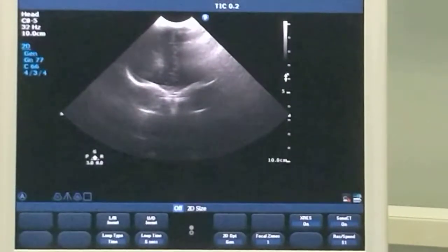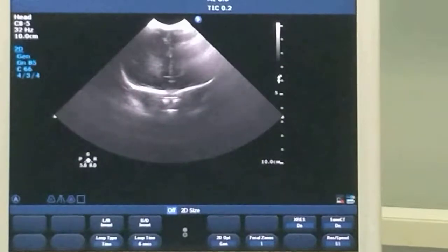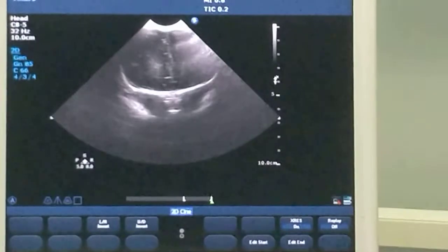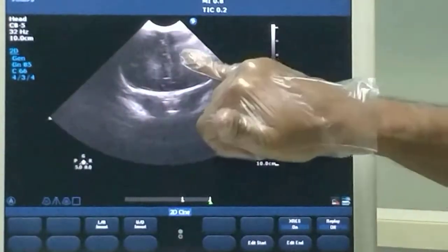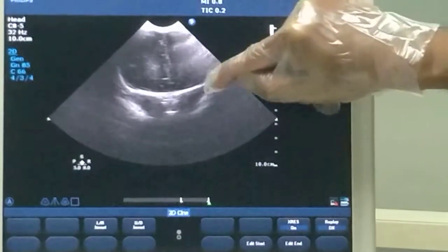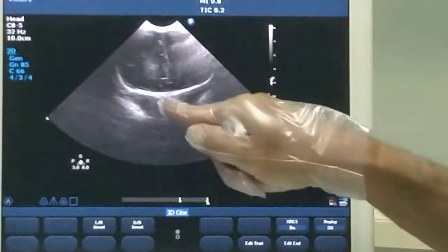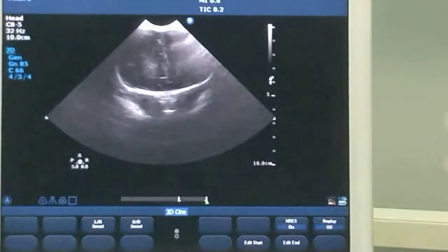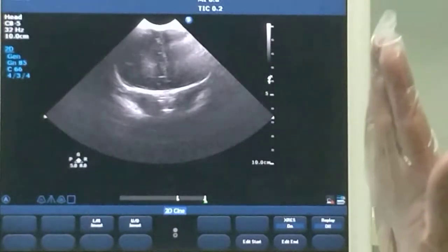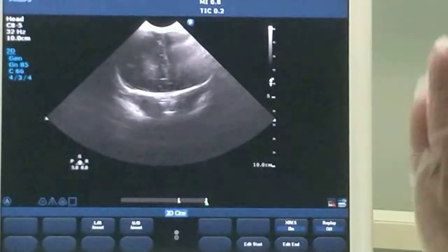I am going to freeze it and show you what these components are. This is the frontal lobe on either side with the inter-hemispheric fissure. This is the orbital ridge, and you can see both the eyes here — the orbit — and this is the nose. This is the area anterior to the anterior horn of the lateral ventricle, also called the pre-ventricular region.